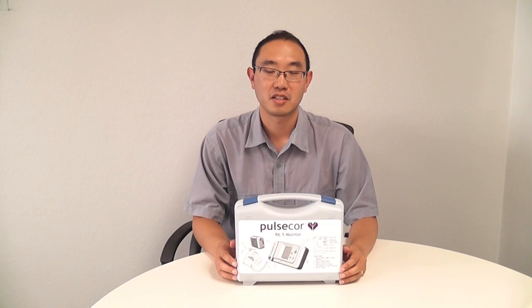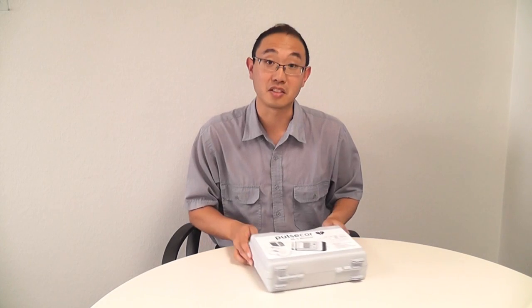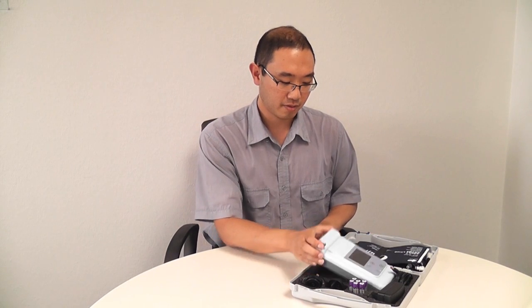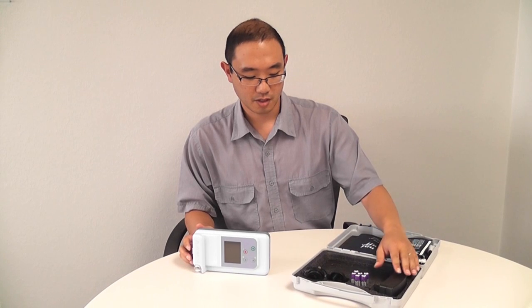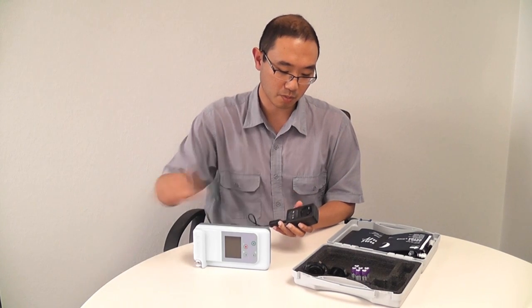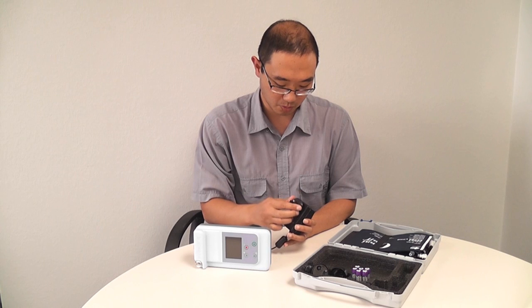This is the PulseCor R6.5 cardiovascular monitor. Let's take a look inside the box and see what we find. Here is the device itself, and it also comes with batteries and a power supply. This is a medical grade international power supply. It comes with a number of different blade sets, and we'll choose the one that is suitable for use here.